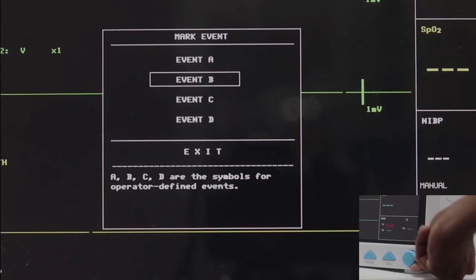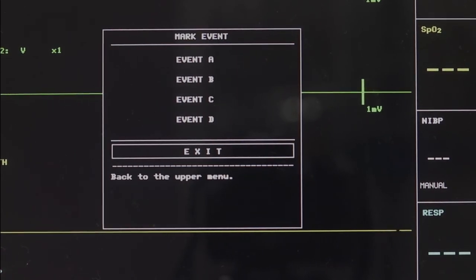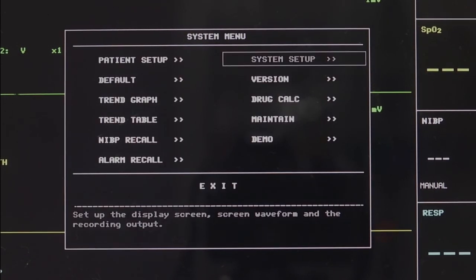Mark Event: The monitor has four types of events. You can specify their representations by yourself. Click on Exit to return to the system menu dialog box.